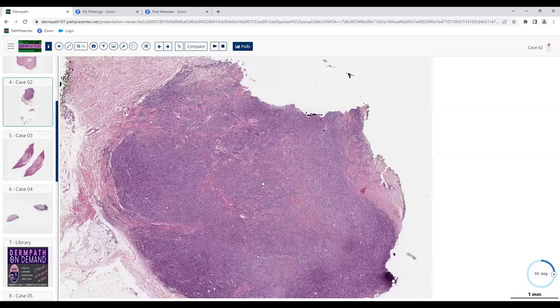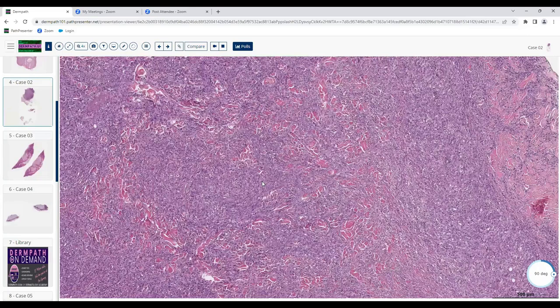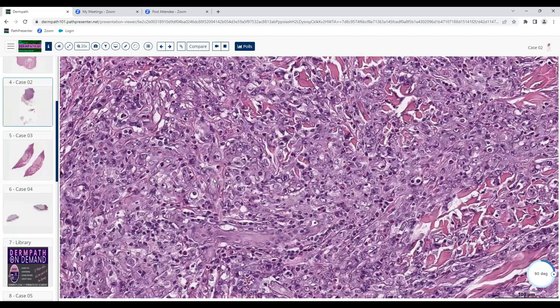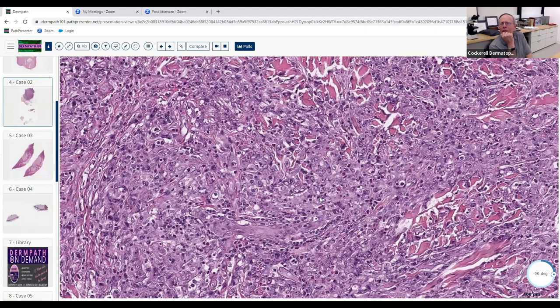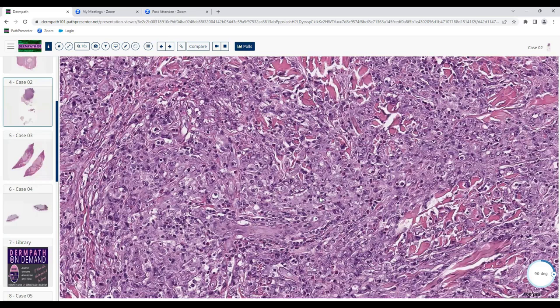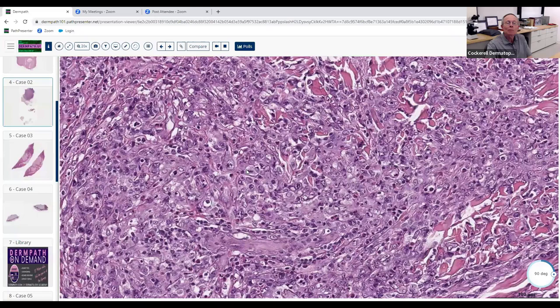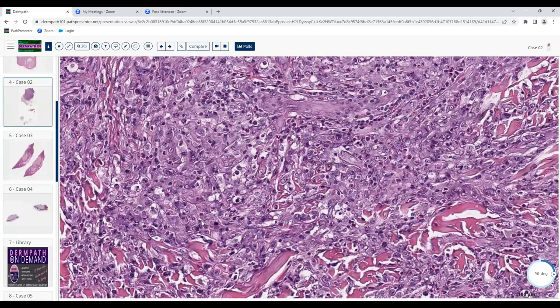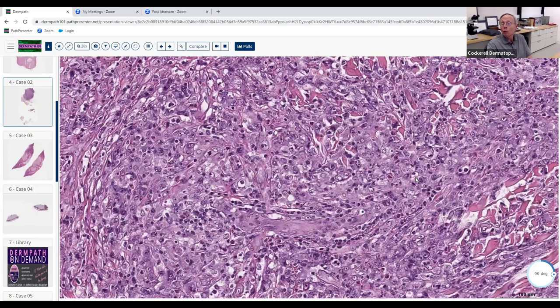Looking at higher power, we have these very large, pleomorphic cells, lots of mitoses, and I thought I saw some horseshoe or donut-shaped cells — hallmark cells — which pointed me toward anaplastic large cell lymphoma. So you're talking about something like this — a sign of a poorly differentiated cell with some anaplasia. Yes. Tell us about anaplastic T-cell lymphoma — if you were going to stain this, what one marker would you use to confirm it?